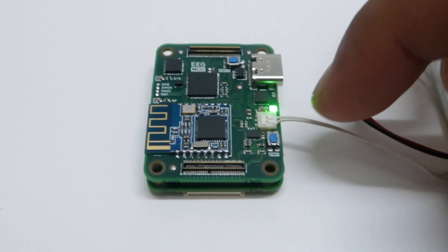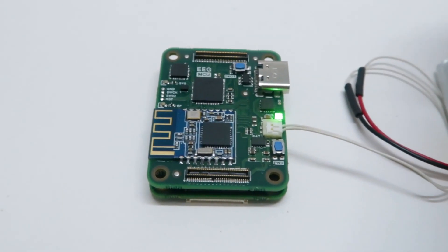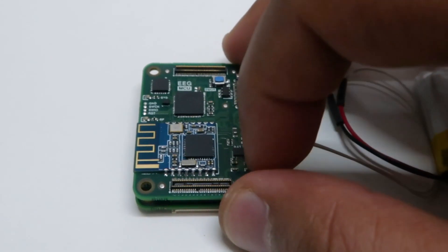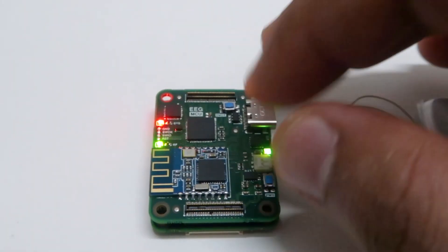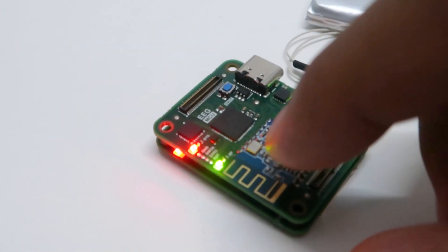Once charging is complete, it will turn green again. This button is the power button, so I'm going to press and hold it for three seconds. Now you can see that the board is powered on — this blinking green LED is the RF activity LED of the HM11.